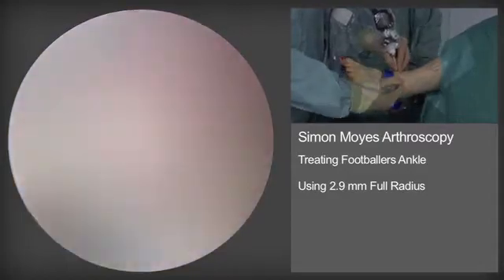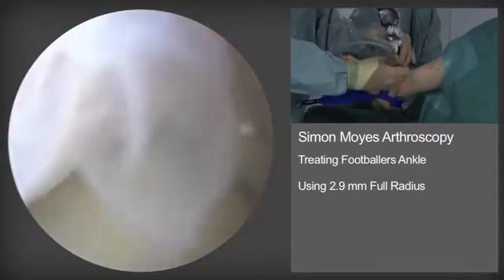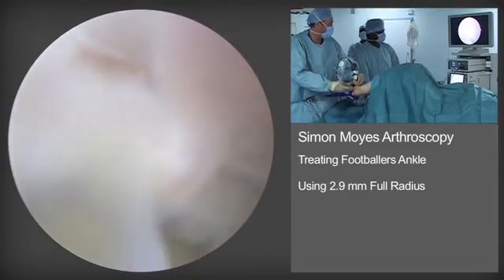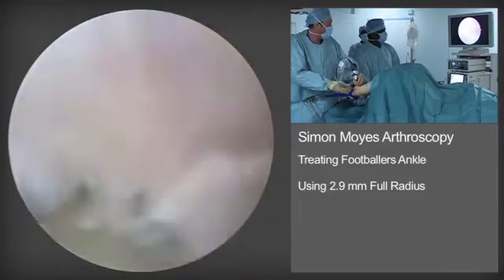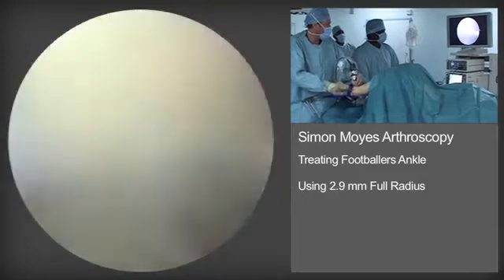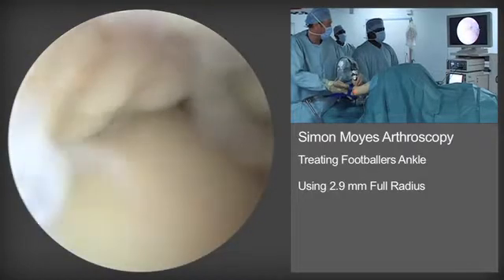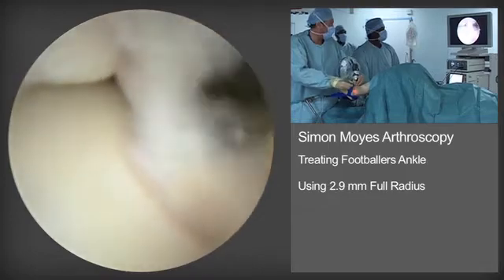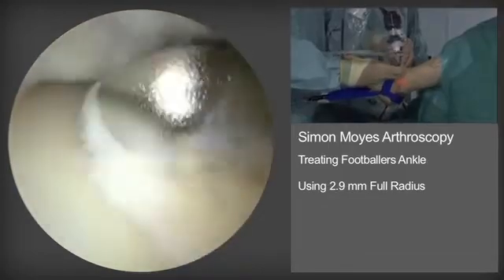Initially, we use a soft tissue resector to perform a synovectomy and clear soft tissue from the anterior compartment so that we can get good visualisation of the tibial spurs. As the synovectomy is performed, the tibial spurs come into better vision medially.